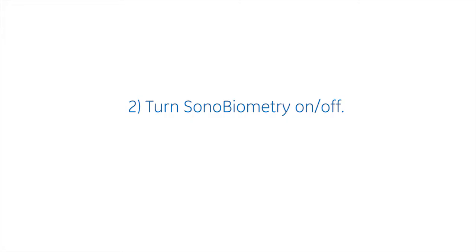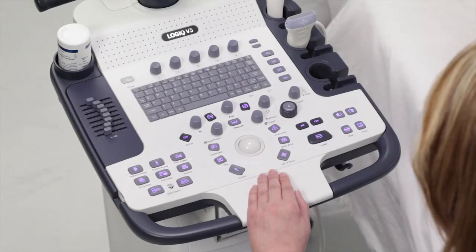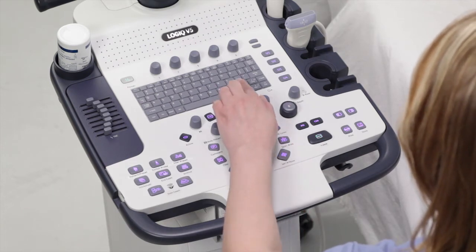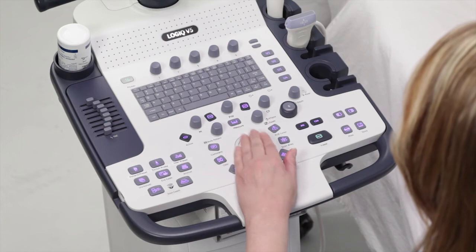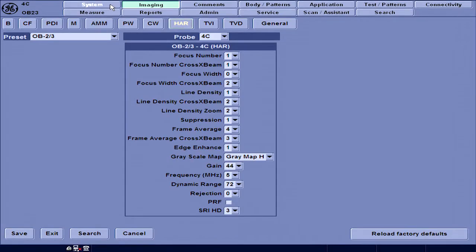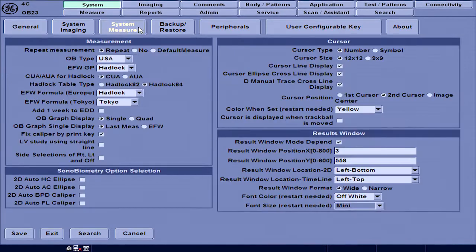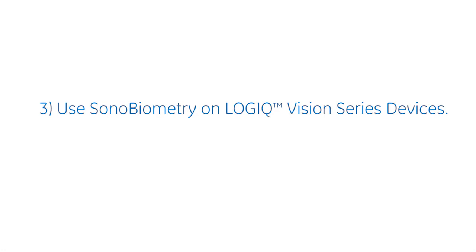How to turn Sonobiometry on or off on Logic Vision Series devices. To turn on this feature, press the Utility button on the keyboard. Then use the trackball to navigate and go to the following path: System, System Measure, Sonobiometry. Select the Sonobiometry option to activate Sonobiometry for BPD, HC, AC, and FL measurements.